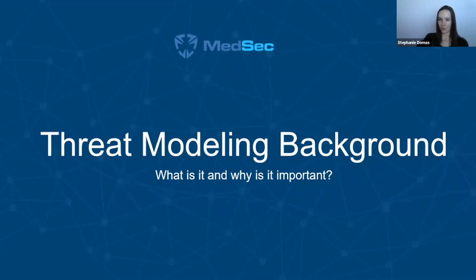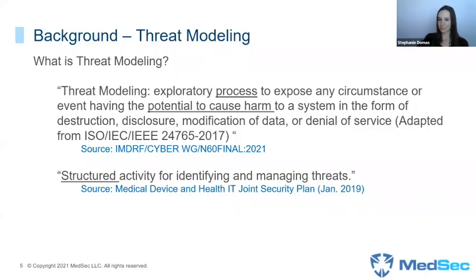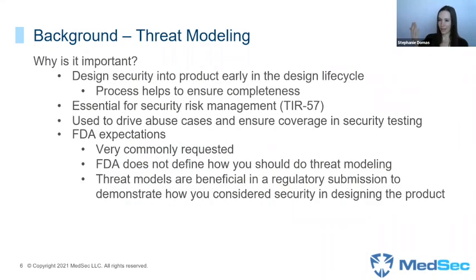All right, so threat modeling background. What is it and why is it important? Just to level set, the whole idea of threat modeling is that you go through a process of looking at theoretical harm to a system. And why threat modeling is so important to get right is that it's a structured activity, right? You're trying to have a methodology that you know is giving you good information. There is no shortage of ways to do threat modeling, but our goal is how do we model the theoretical threats against the system in a structured way? Okay, that sounds great, but why is it actually important?